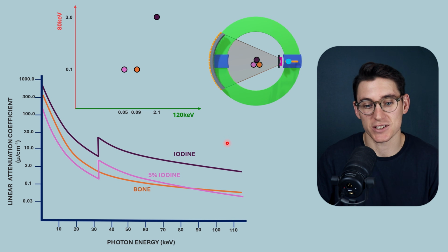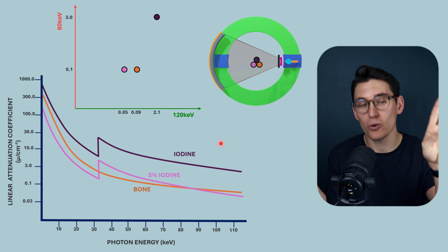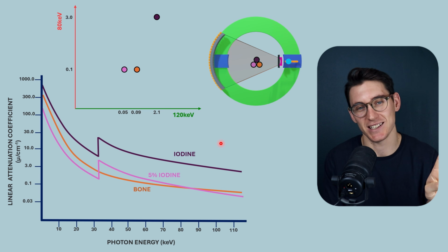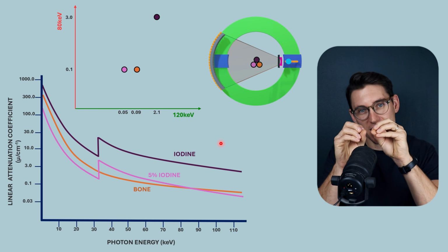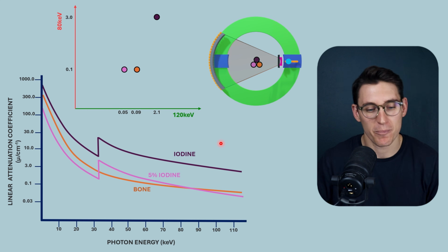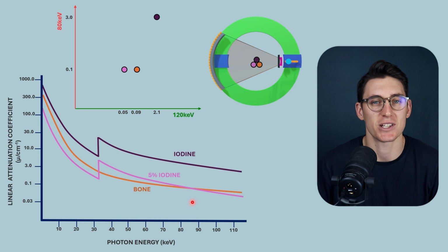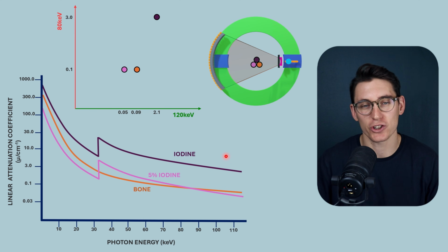And that's exactly what dual energy CT boils down to. Applying 2 different energies allows us to separate tissues based on their response to the differing energies, based on their rate of change of linear attenuation between the 2 energies that we've selected. Tissues are going to respond differently.